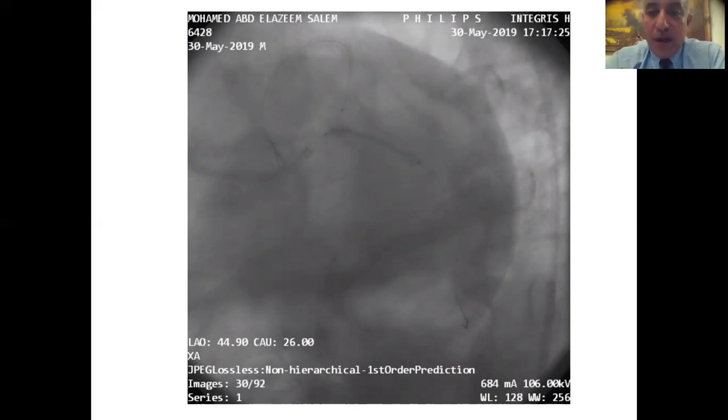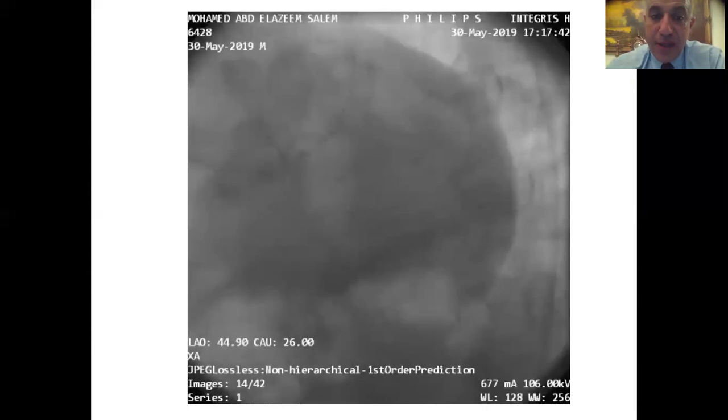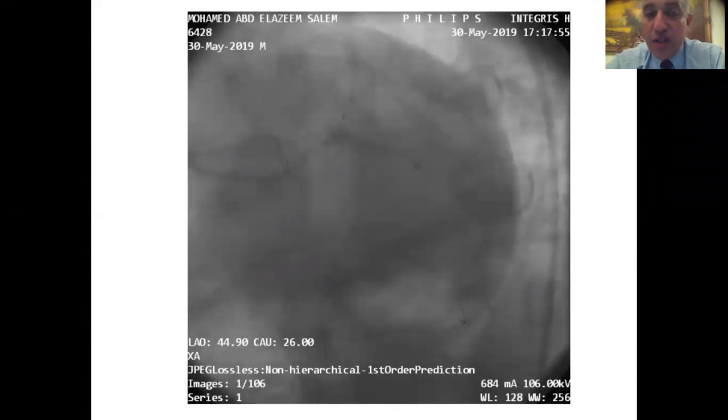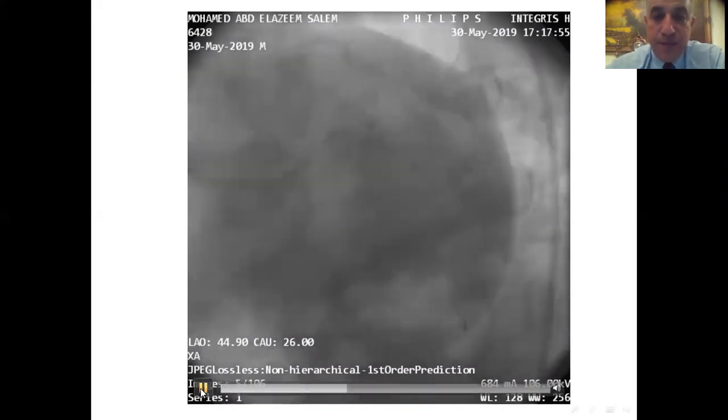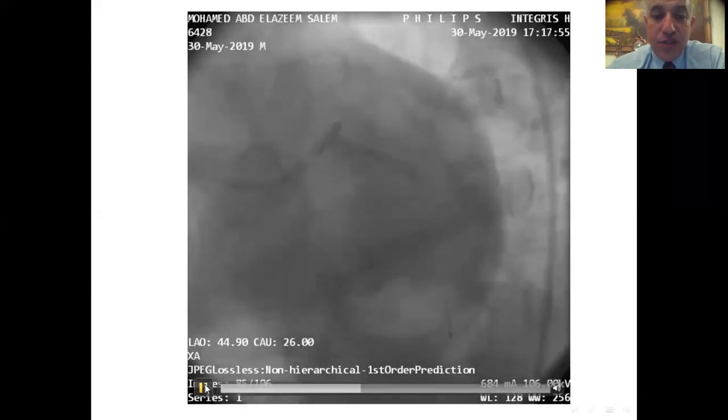The first step in the DK crush is that we stented the ostium to the proximal segment of the LCX, as you see here. This is the stenting of the LCX. And we have, as you see here, a balloon parking in the LAD to do the first kiss. This is the second step in the DK crush, to do the first kiss after the deployment of the first stent in the LCX. Now we will see here the first kiss.